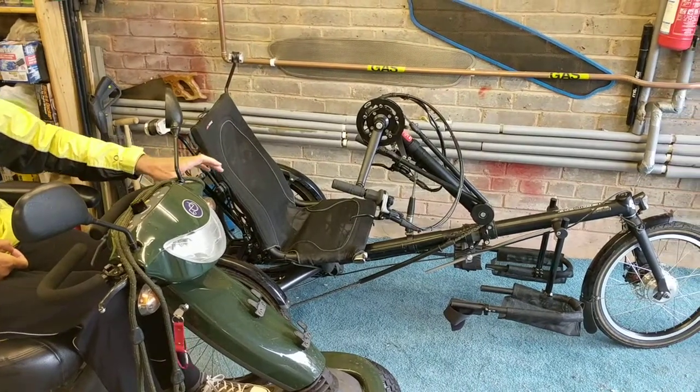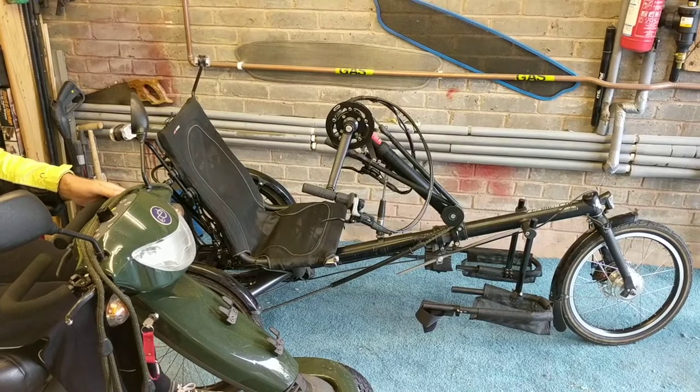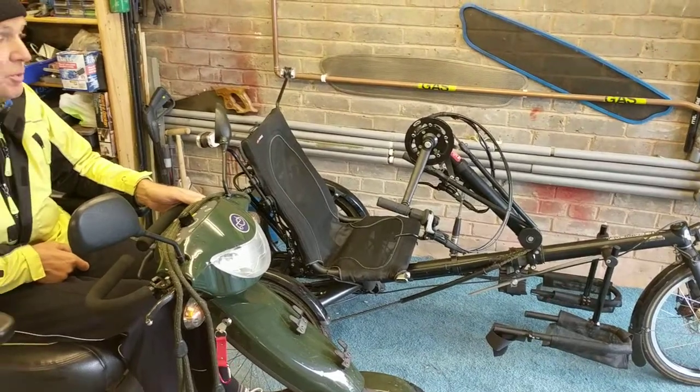Changing the brakes, changing bits and pieces, altering the lengths. So this is going to be called Christine 2 when we've finished it, and this is the first day's work. We'll keep you posted.